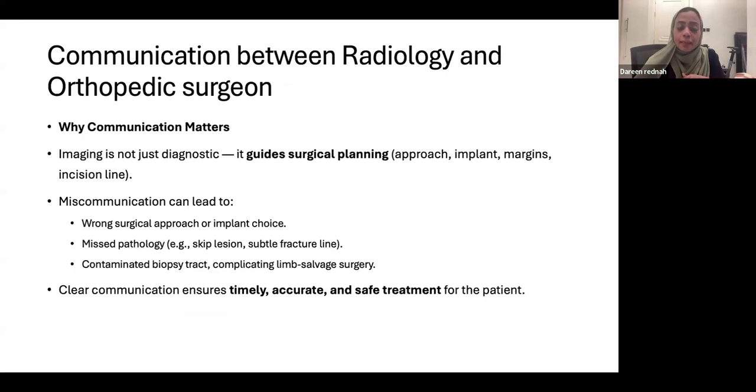We have templating for arthroplasty based on the X-ray. We have CT scans, we send them to customize an implant for a patient, especially pediatric. So if the image is not good, that means the surgical implant choice will not be good. That means failure to plan is planning to fail.